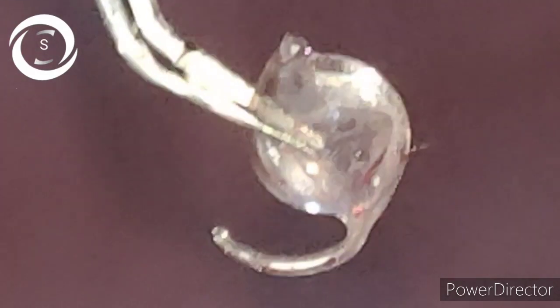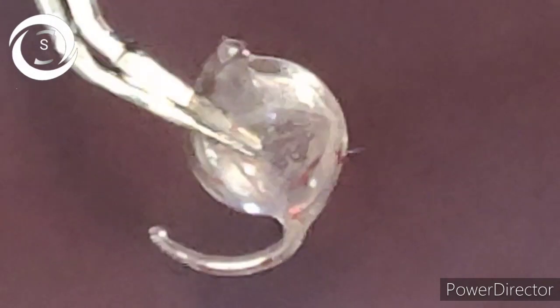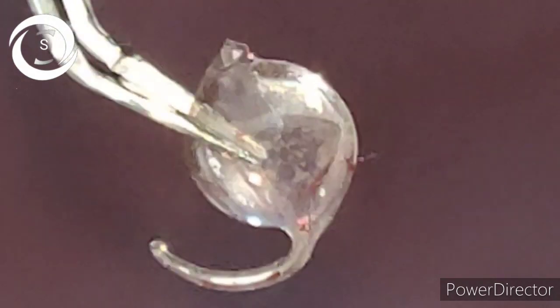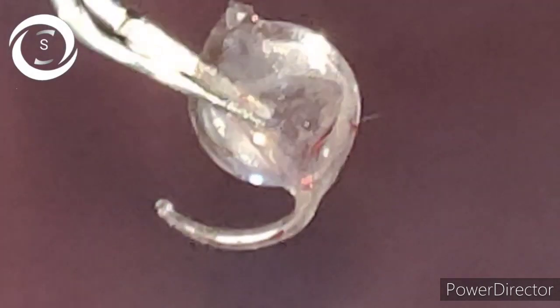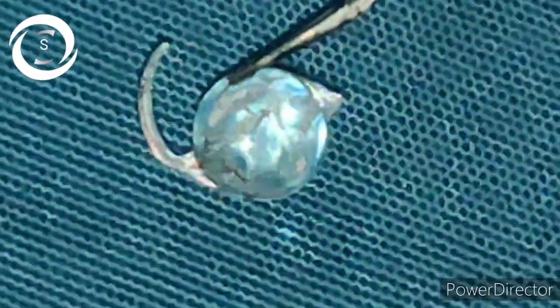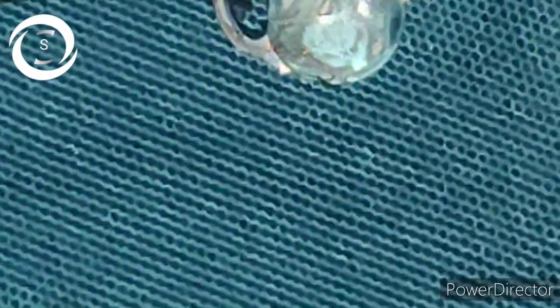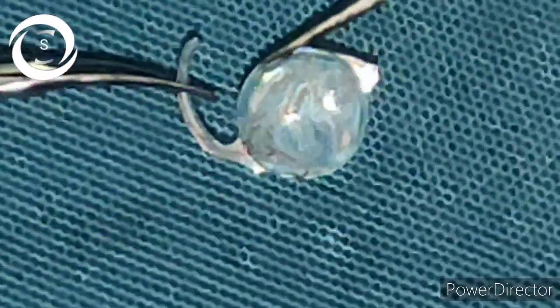Number three: in case you do all maneuvers and the haptic is broken, assess how much of the optic-haptic is missing. If it is broken at the optic-haptic junction — like here you can see — then by no means should you leave it in the eye. Like today, I replaced it without a second thought. If the haptic is half present, I would try to cut it with scissors. If one haptic is full and one is half — like here — you can safely implant it in the bag and it will not dislocate.